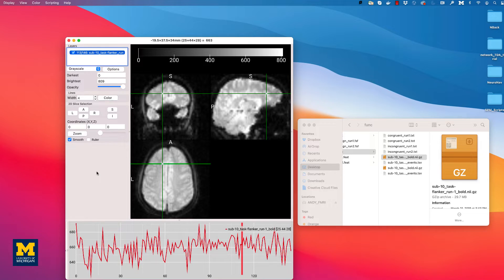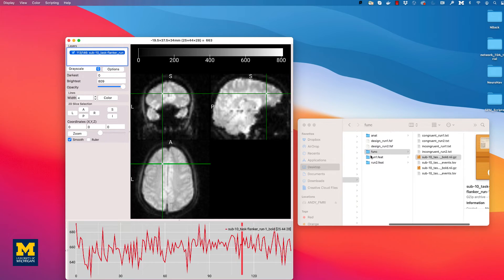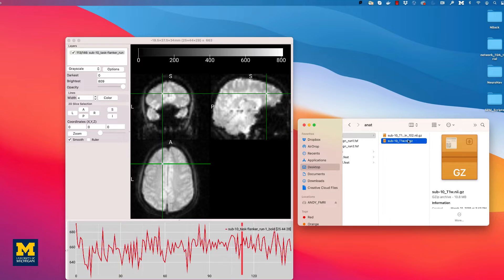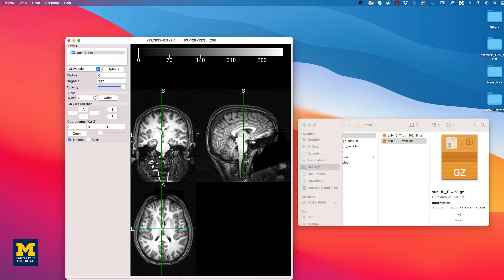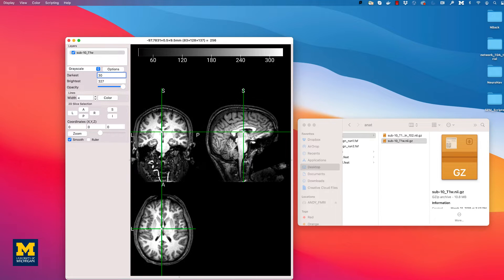Next, we will load an anatomical image. In this case, the T1-weighted sub-10 underscore T1W image from the sub-10 anat folder in the Flanker directory. If you click and drag it into the graphical user interface, you should see something like this. Modifying the values in the darkest and brightest fields is useful for setting the thresholds for which voxels will be shown.